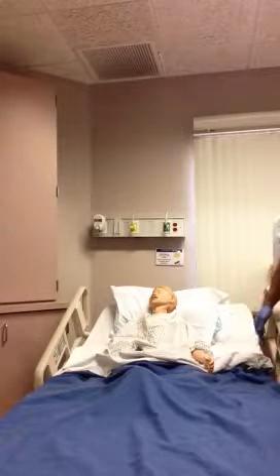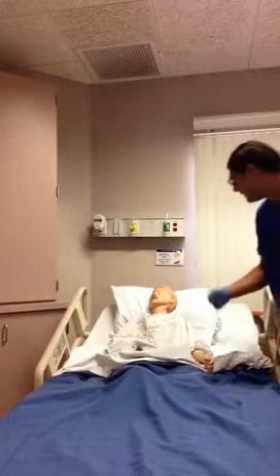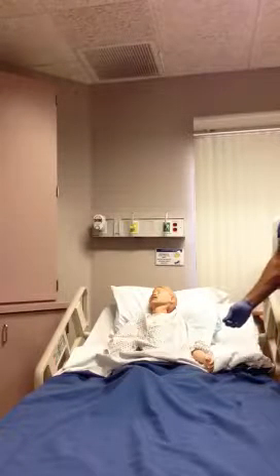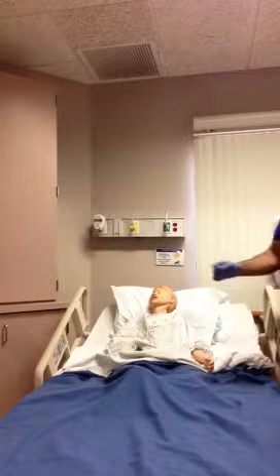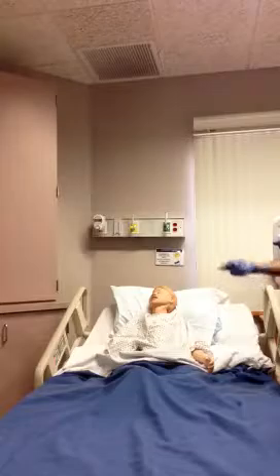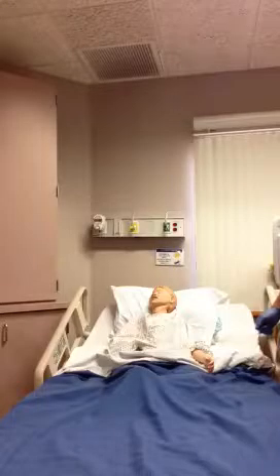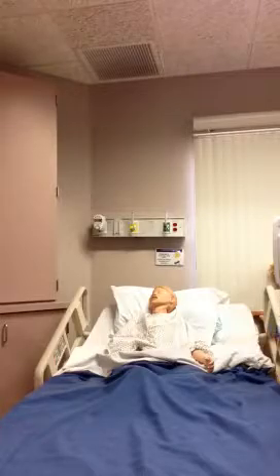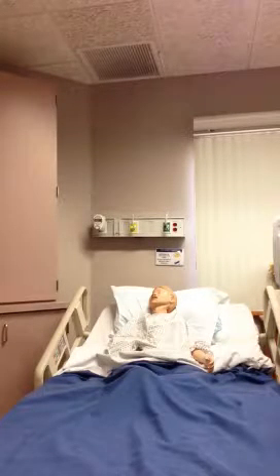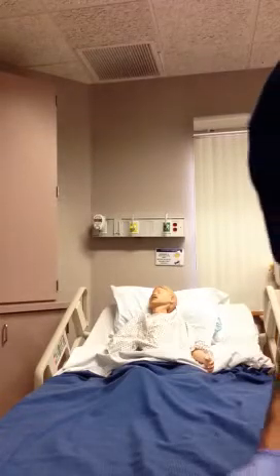At this point, I'd lower the patient, make sure they're within reach of the call light, let them know the procedure's done. Okay, we finished that procedure. If there was still some bleeding, I'd let them hold the cotton swab on there until the bleeding stops, which is sufficient a lot of the time. Otherwise, I'd give them a Band-Aid, give them a choice between Hello Kitty or Ninja Turtle Band-Aids, and make sure they didn't need anything else before I left the room to get the medications that I'm going to administer. Okay, and then I do hand hygiene on the way out.